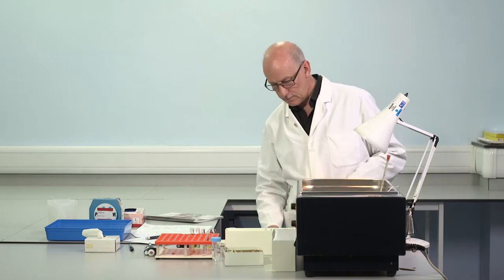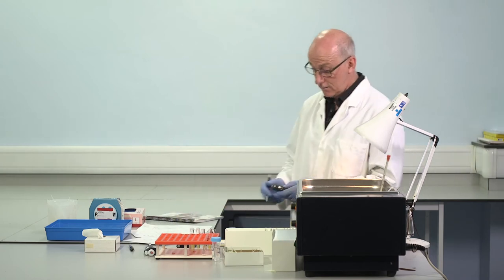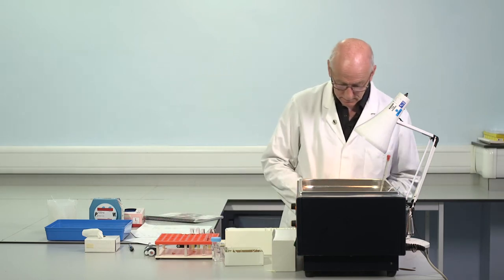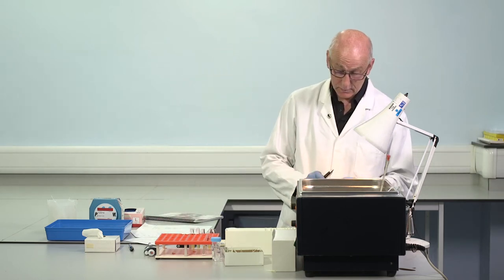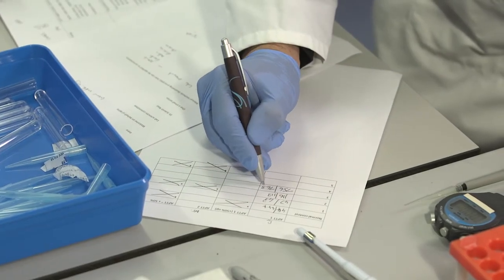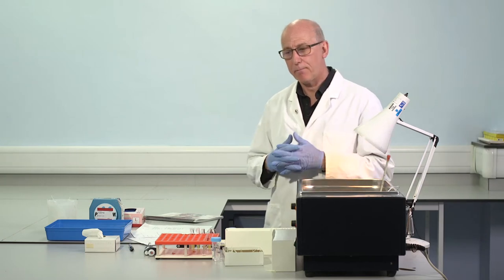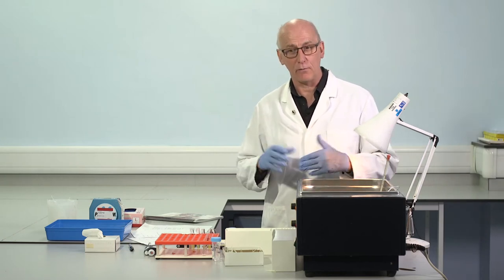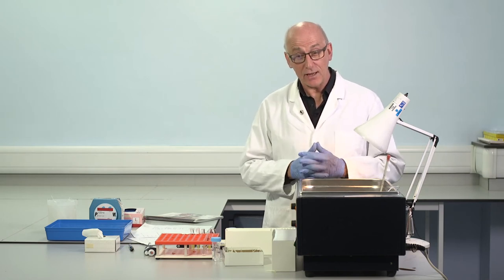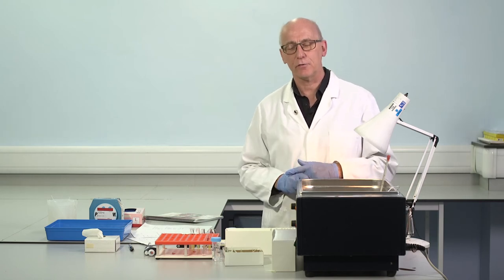We'll just record this value on number 3. 75.6. 76.5. So the reference range for this method we're now using, we've established it locally in the way that I've described. Same tubes, same blood collection tubes as those used for patients. 20 to 25 normal subjects.